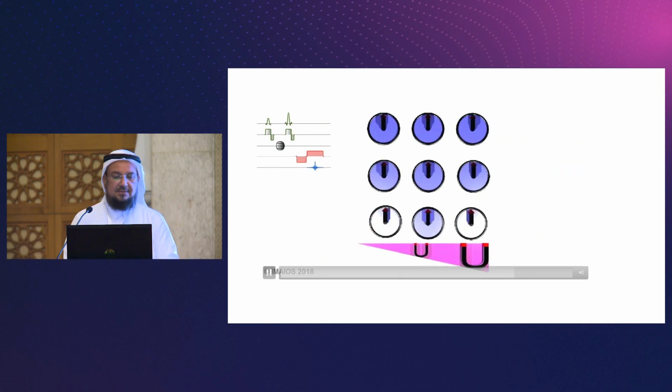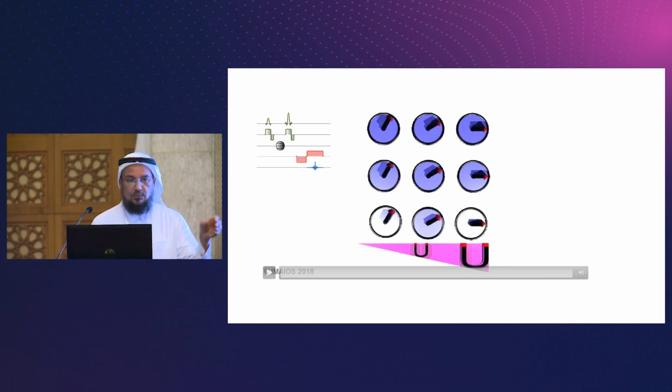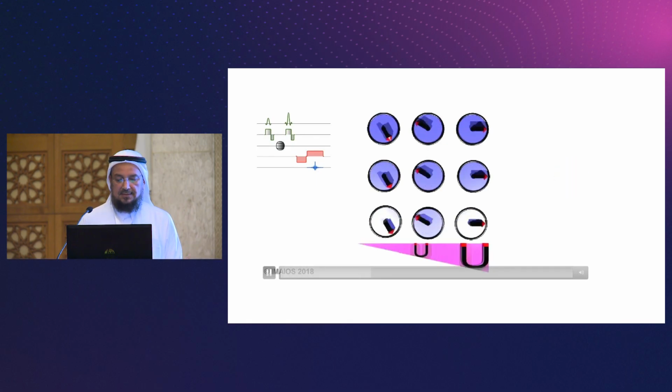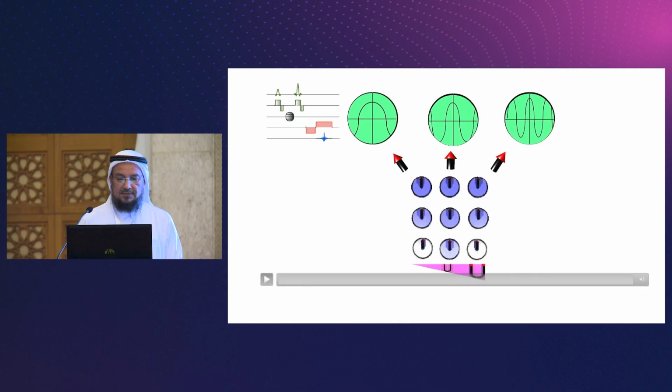Those protons in this column will have higher frequency than the ones in the middle. The one in the middle will have, again, higher and higher. So this is applied for 3 columns, but in imaging we have like 256 or 512 columns. Each column has a different frequency, and when the wave is picked up by the antenna, it will know whether it is coming from the right side or the left side of the image, according to the frequency that it carries.